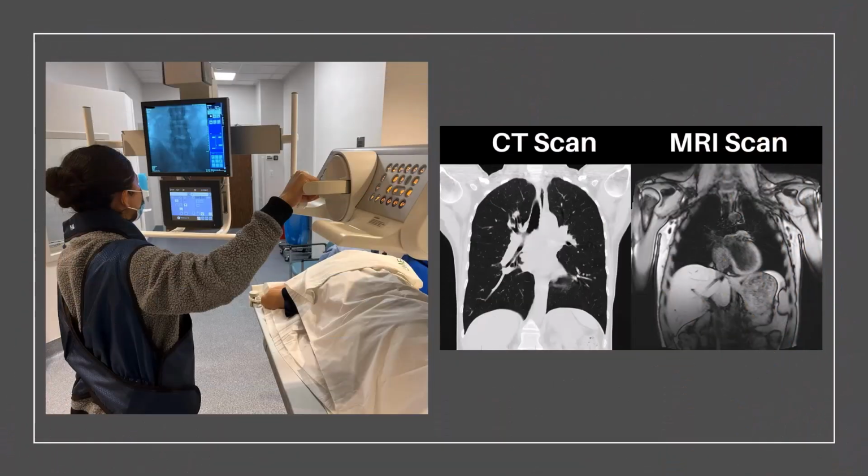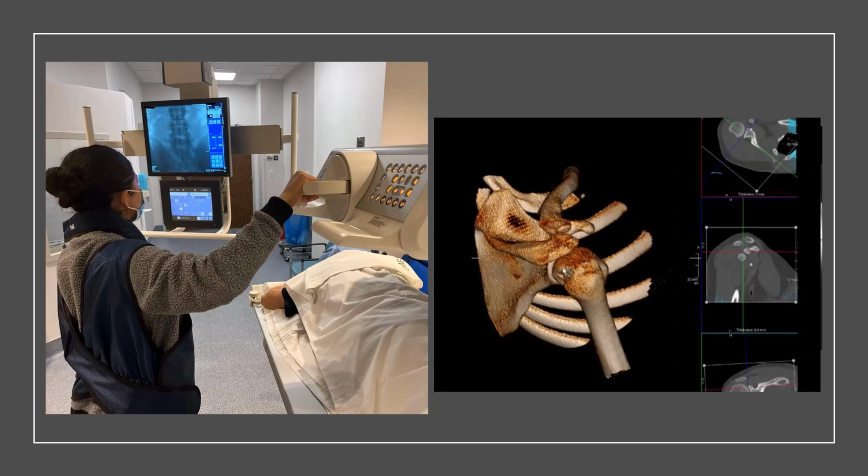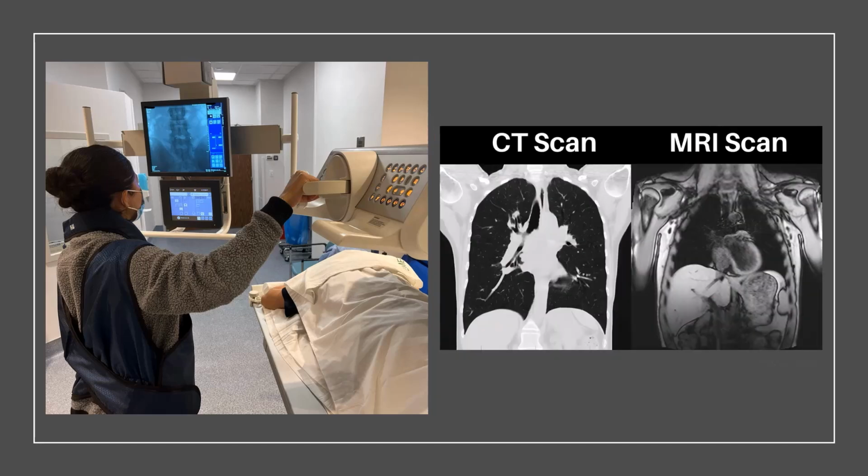Why use CT scans and MRI as opposed to doing fluoroscopy? The advantage of a CT scan is that the CT is digital and fully volumetric, so it can provide pictures of tissues, organs, and skeletal structure. And CT is faster than MRI. It's particularly useful for imaging blood in the brain during stroke triage.